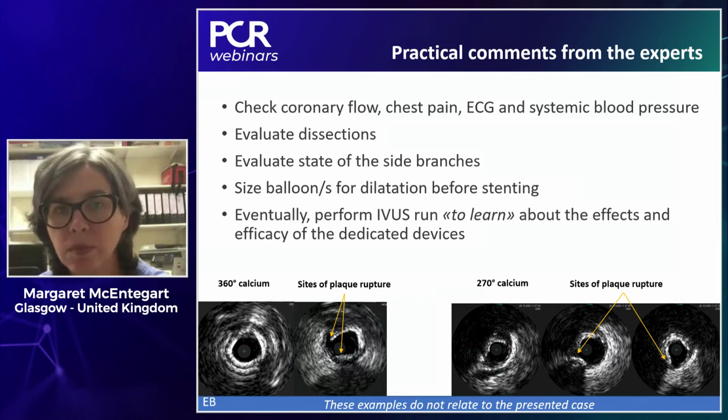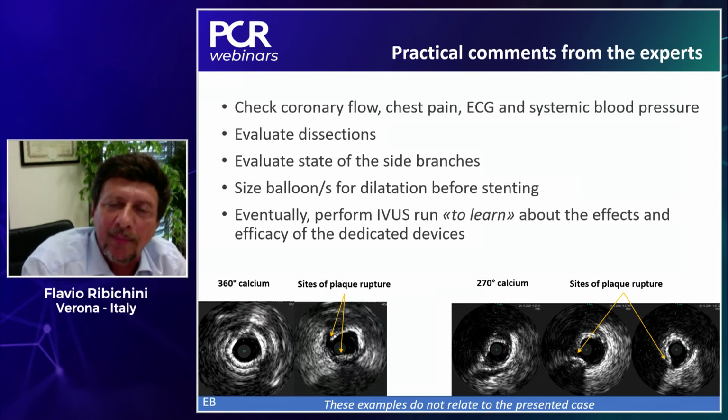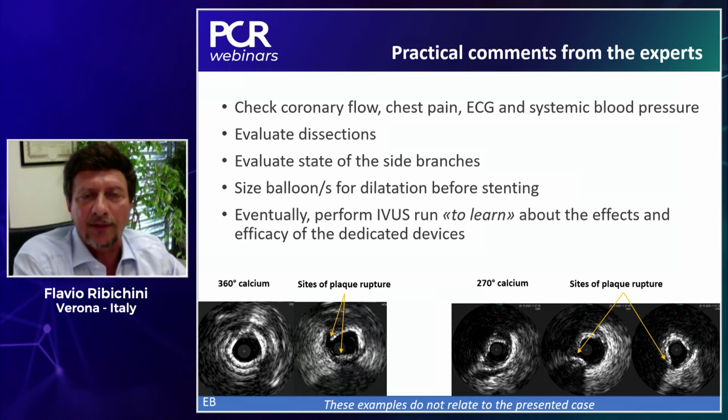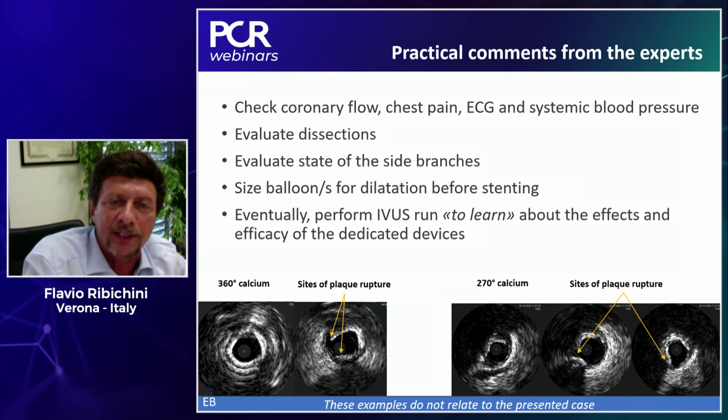So, Margaret, this is an important point. Sometimes you get a little bit disappointed when you see the angiogram after rotation, because it seems not to be a big difference. It's not a balloon that you open and you eliminate the stenosis. You have to get used to that, and you have to trust that the device has done its job. And Emanuele, after you have done the rotational atherectomy, which are the key points you have to concentrate on to make sure that you still keep your procedure and your patient under control?